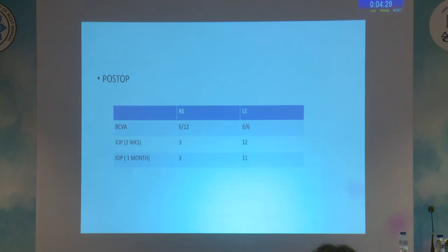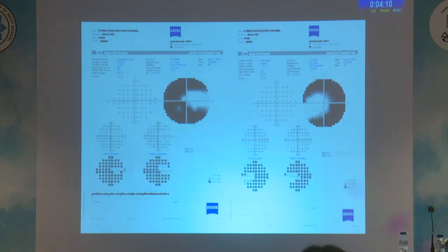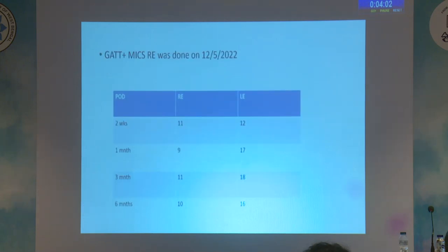Postoperatively, the patient's intraocular pressure was under good control, thereby avoiding complications as well. Next is a 60-year-old female patient who was a known case of primary open-angle glaucoma and was on maximal medical therapy. This patient had advanced glaucoma and uncontrolled intraocular pressure. The field report shows the uncontrolled nature of the glaucoma and the advanced field defect almost approaching fixation.